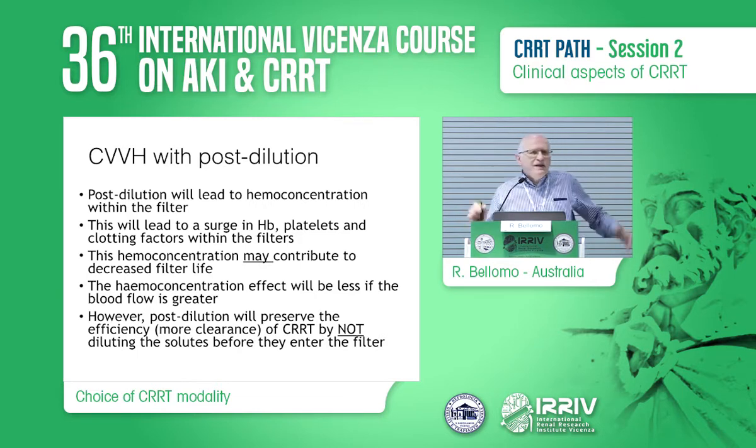So some of you might say, oh yeah, no, I don't want to decrease efficiency. I'm a kind of an efficient kind of guy, so Italians wouldn't worry about that, right? I'm an efficient kind of guy. I'm from Germany, and I want to do it efficiently. And so I'm going to move to post-dilution instead.